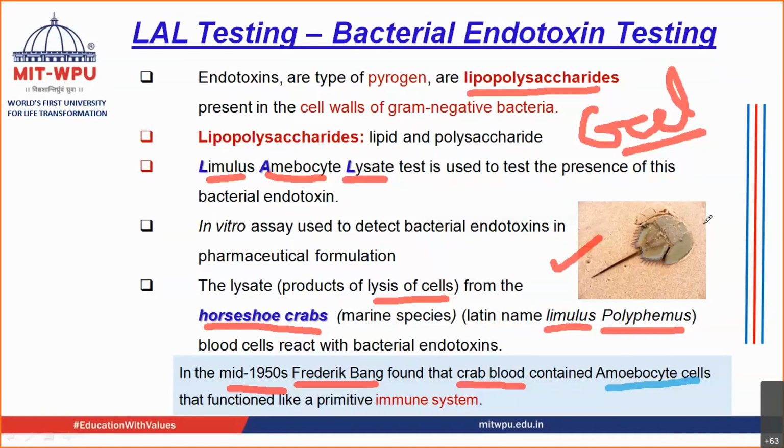So we extract this blood, and the amebocytes, when they react with lipopolysaccharide contained in gram-negative bacteria, cause the jelly.